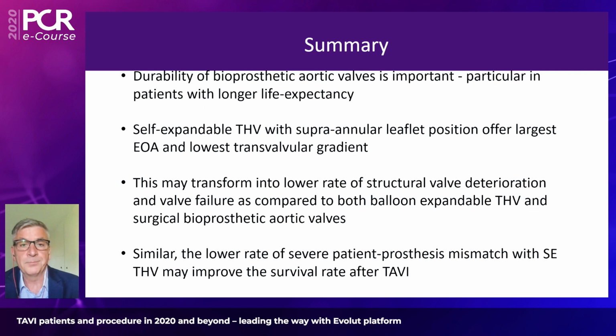Okay, Lars, that was a very compelling presentation. What I always ask myself is about the elephant in the room, at least with surgical bioprosthesis. We know that the younger patients are when they get a bioprosthesis implanted, the faster the degeneration process occurs. Do we have some signals there with TAVI as well? So meaning that if you get your valve at a younger age, these TAVI valves will degenerate faster?